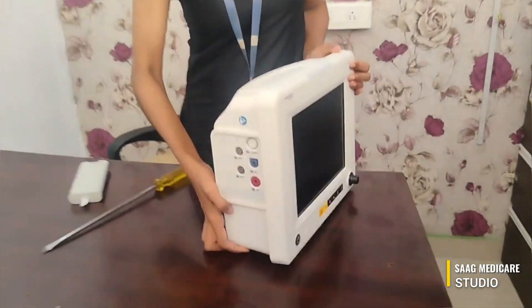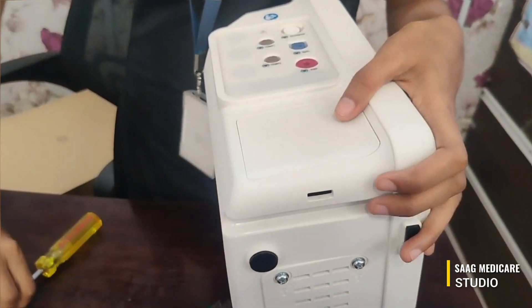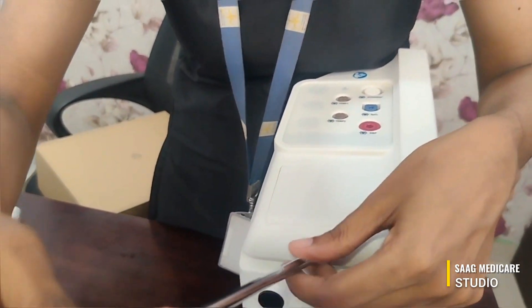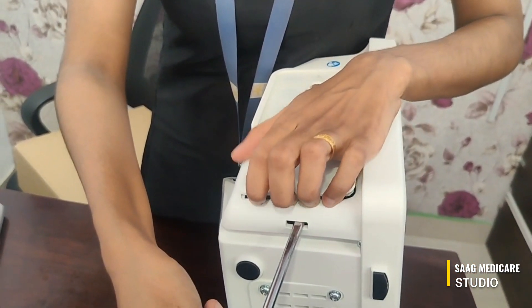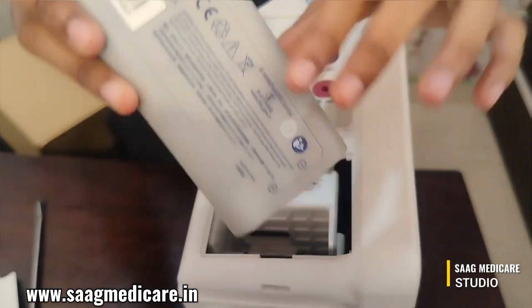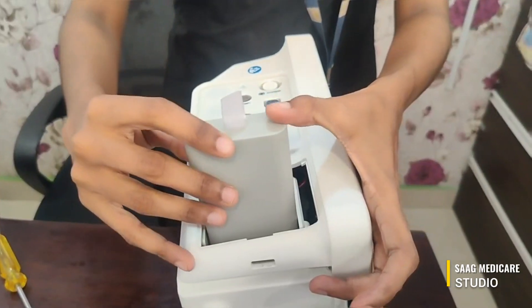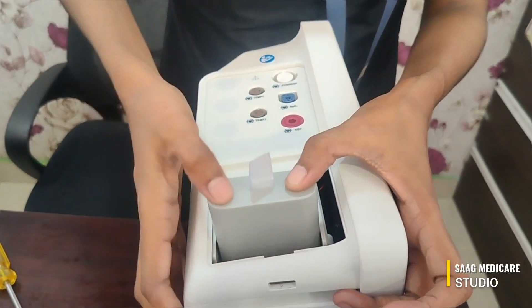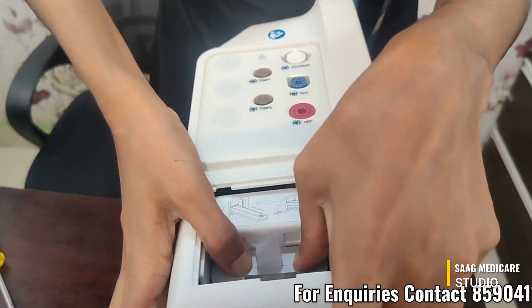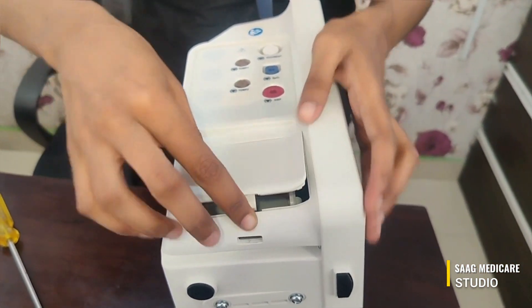On this side of the machine we can see one port. It is pressed open using a screwdriver. Take it like this and insert the battery in this position. We can insert the battery like this — just press here and insert it to stop.